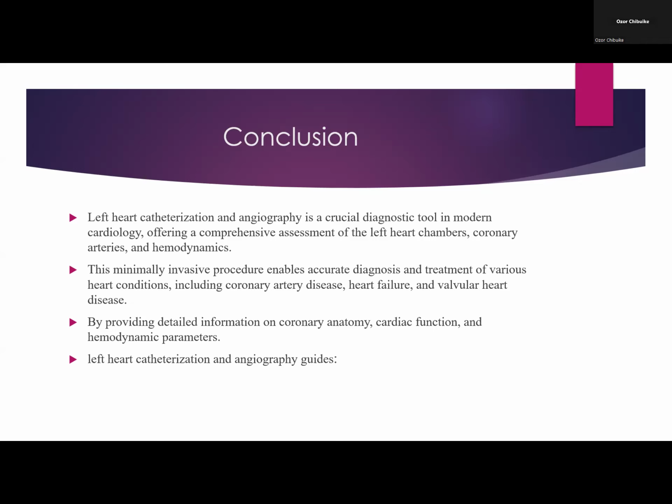As well, with cardiac catheterization, it also helps us to identify the different classes of pulmonary hypertension, by providing detailed information on coronary anatomy, cardiac function, and hemodynamic parameters.